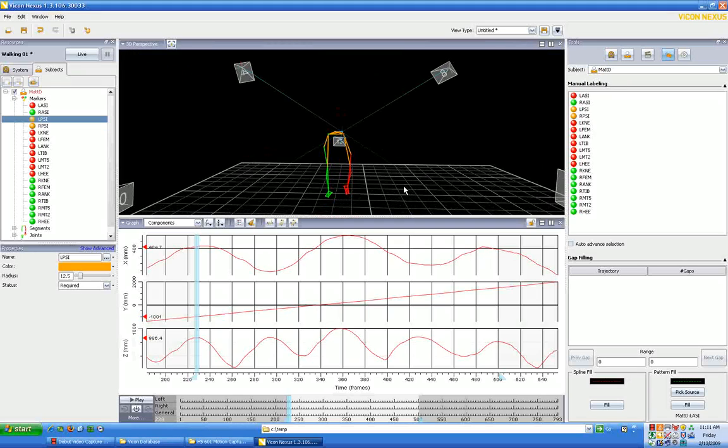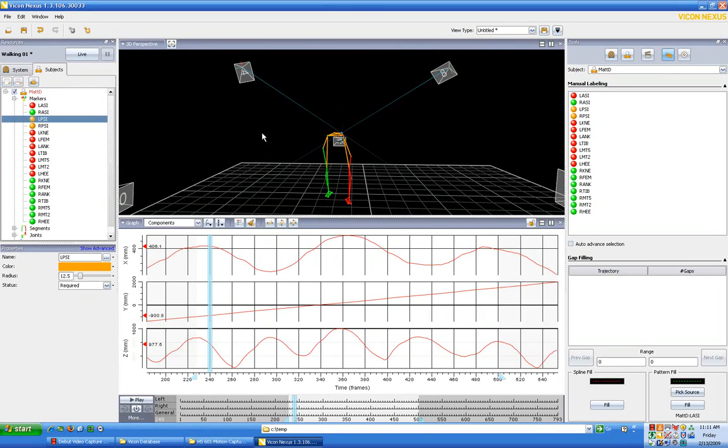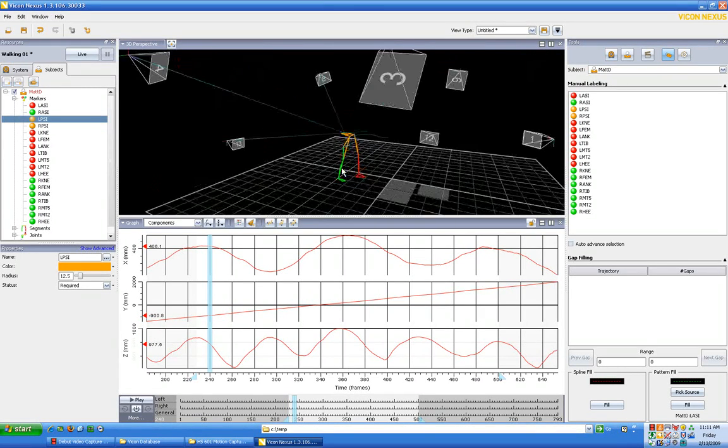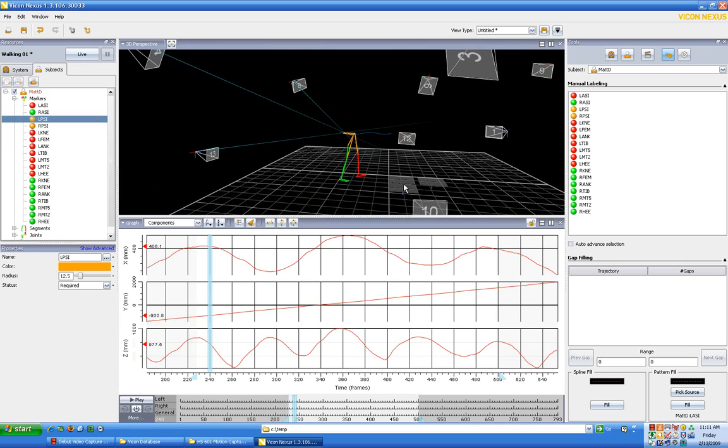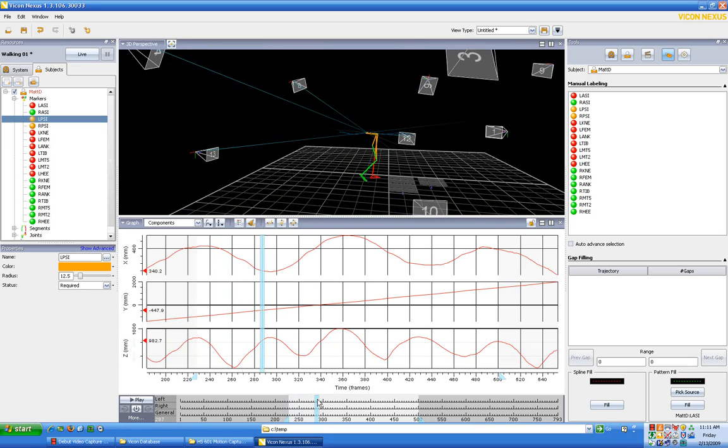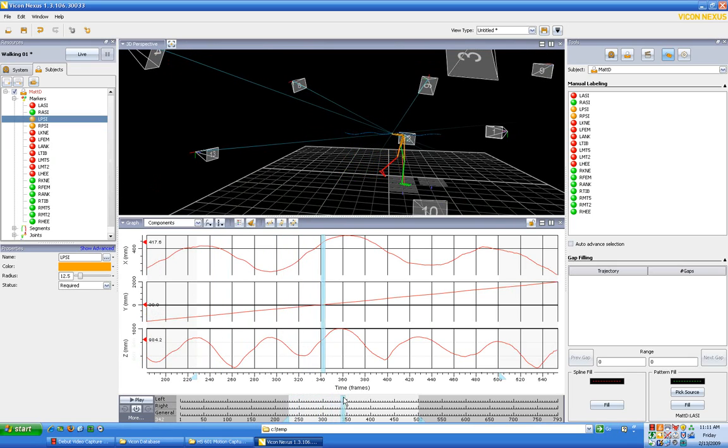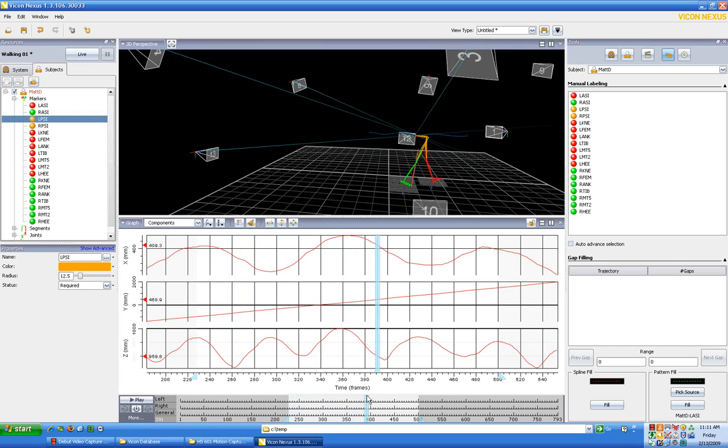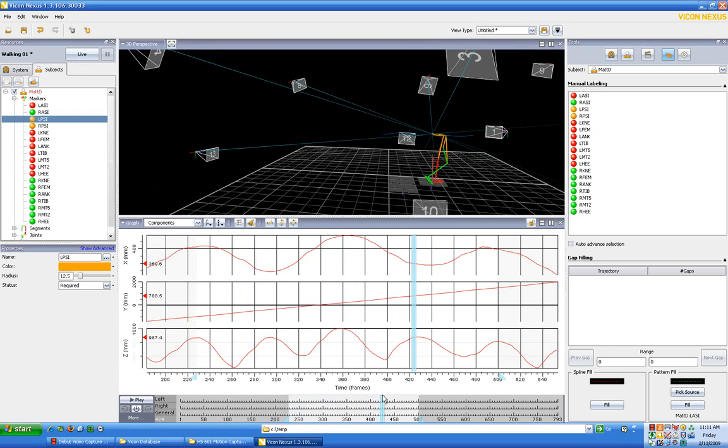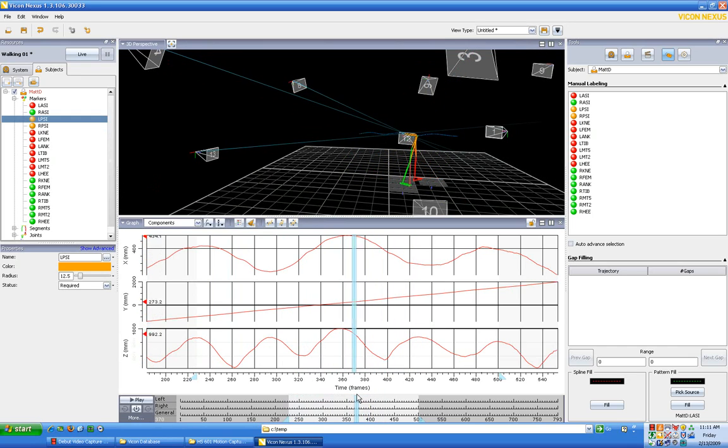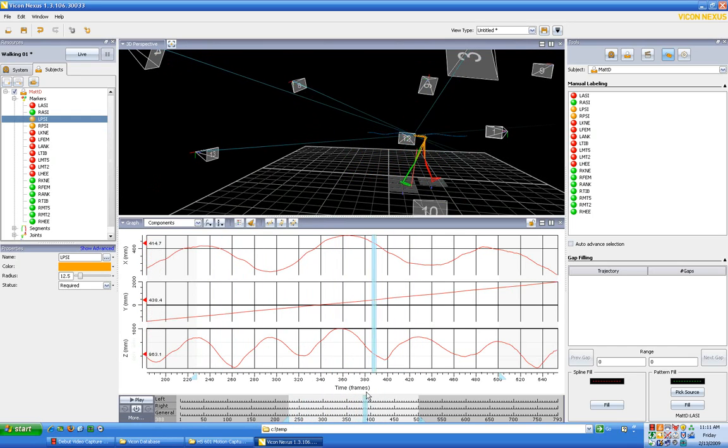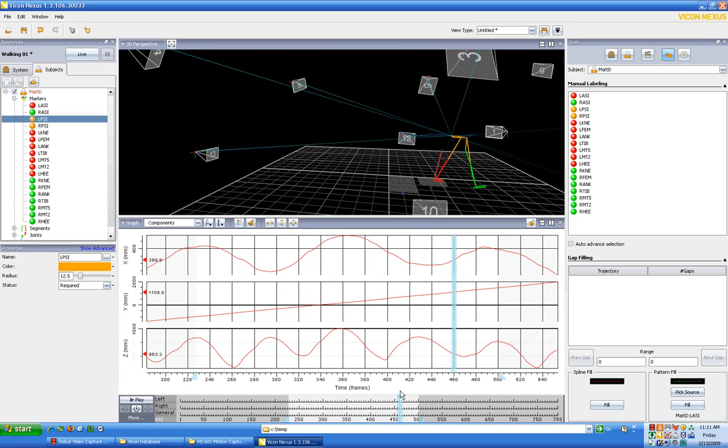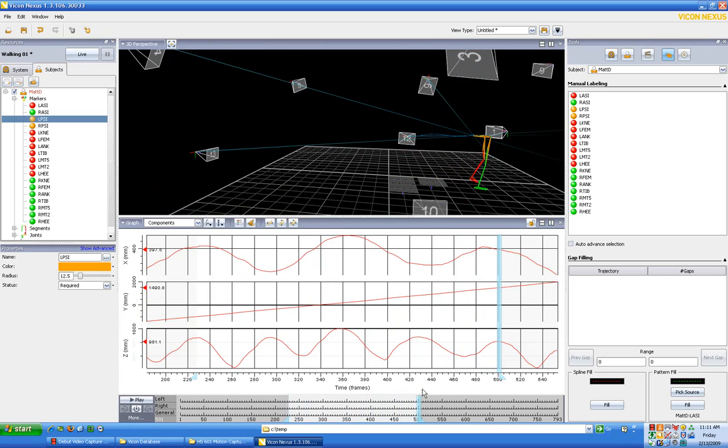So this is good. Now, had we calibrated our subject, we could actually run a modeling on this and determine things like changes in joint angles, velocities, how much force is present at the joints and things like that. But again, I'm going to save that for right now and just show you how to track the dots for a simple sequence like this.